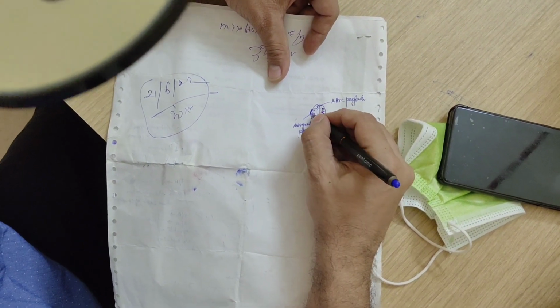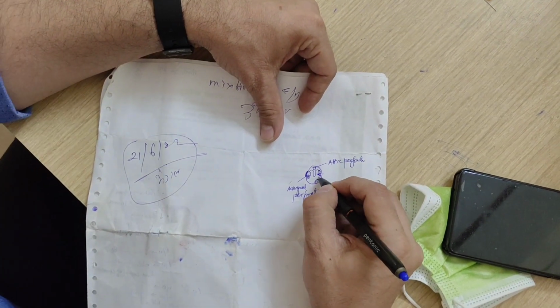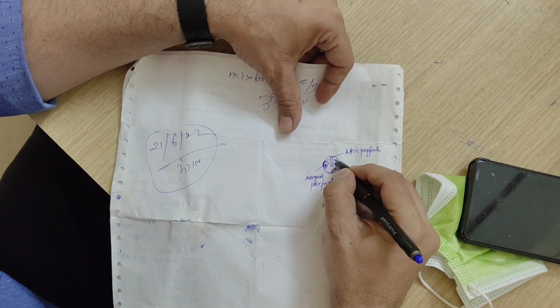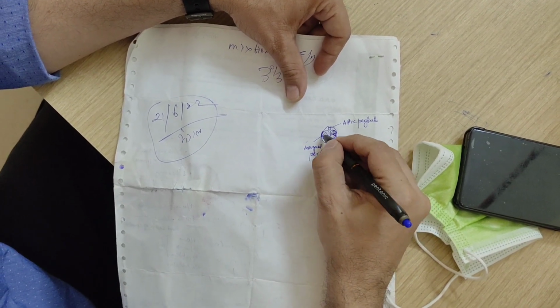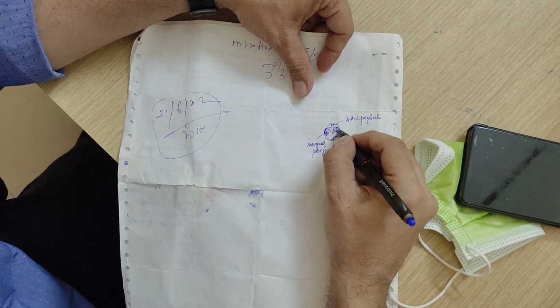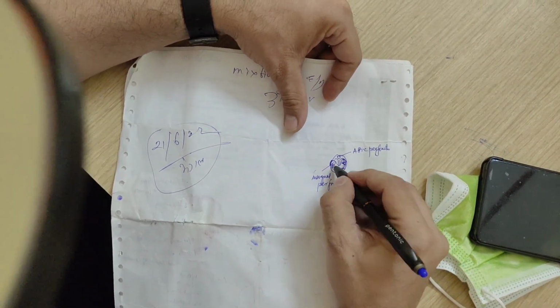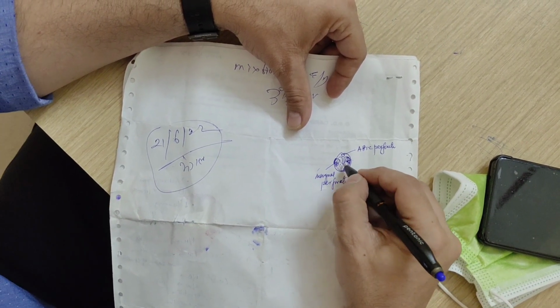So based on where the perforation is, if the perforation goes over the area of the posterior-inferior, it is involving the antero-superior, antero-inferior margin also, as well as the posterior-superior area. So if it is a large subtotal perforation, then you have to comment about the visualization of the incudostapedial joint and the stapes suprastructure and the round window niche or the Eustachian tube gutter, and of course the promontory.